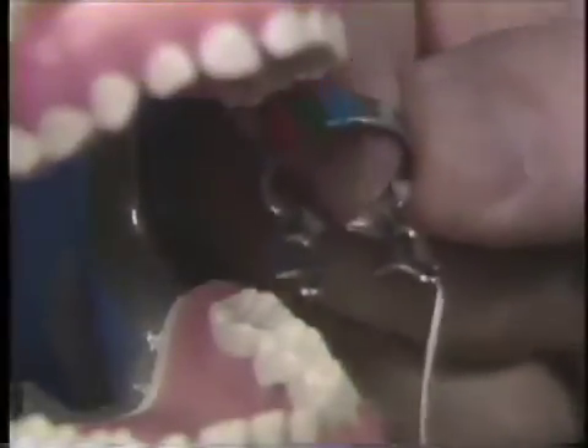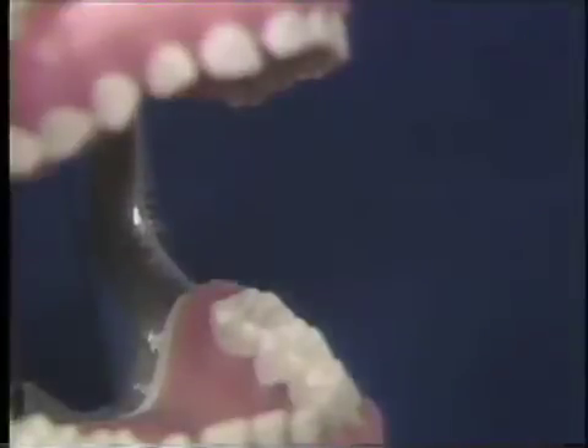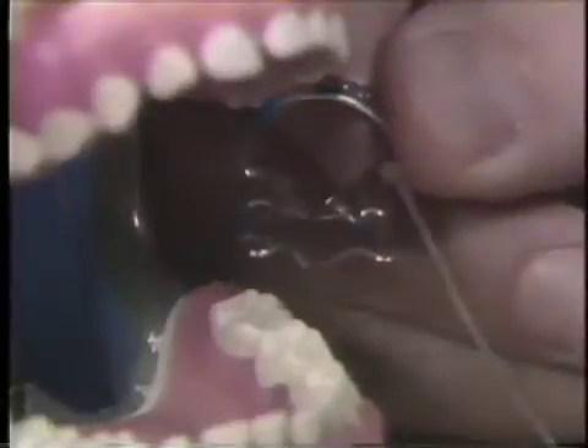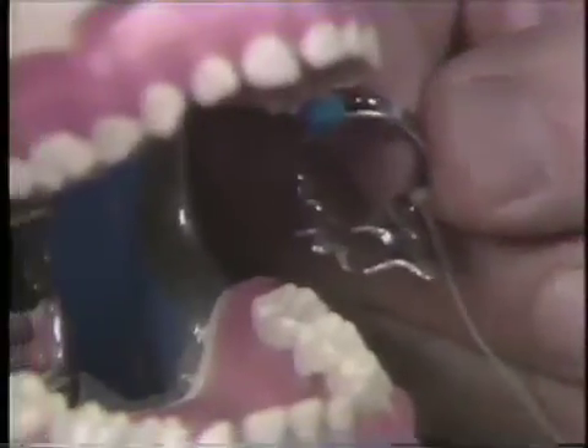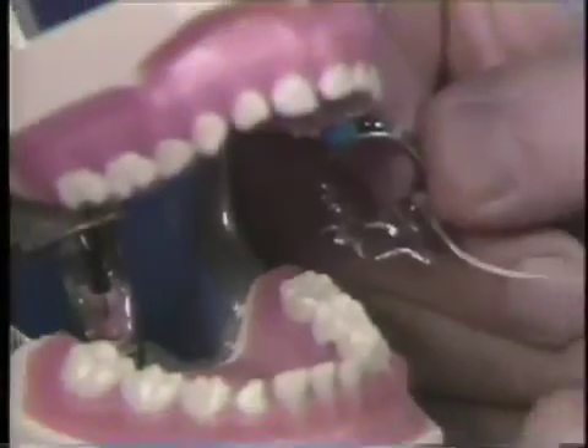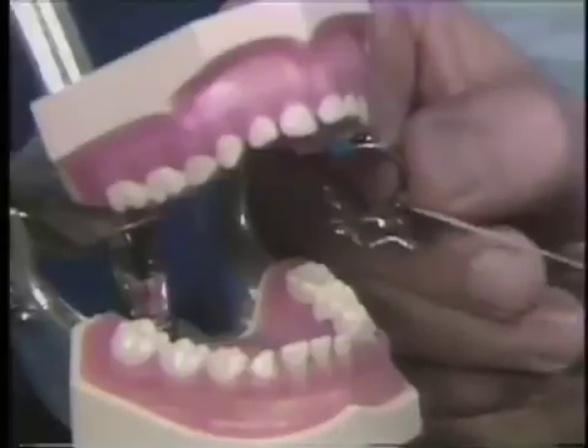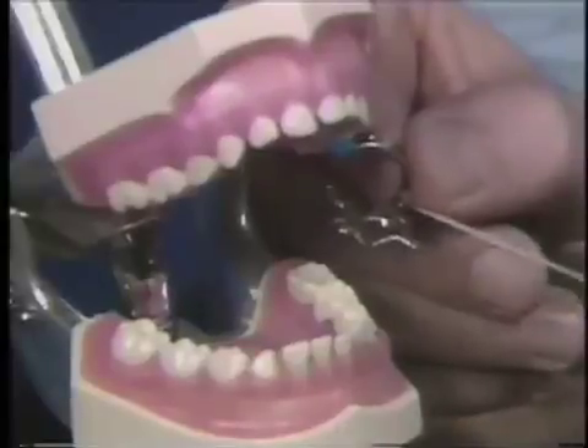The two rubber dam clamps commonly used in pedodontics are the Ivory number 14 and number 14A clamps. The number 14 clamp is used on all primary second molars and on all small permanent molars. The number 14A clamp is used on permanent first molars. A long length of dental floss is tied on the clamp before it's put into the mouth. In the event that the clamp is dislodged from the tooth or comes off the clamp forcep, the dental floss makes the retrieval of the clamp very simple.